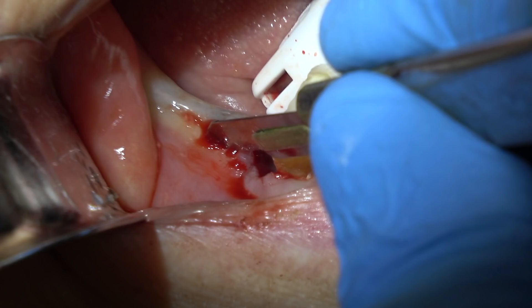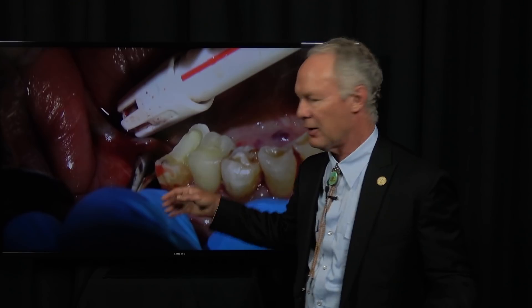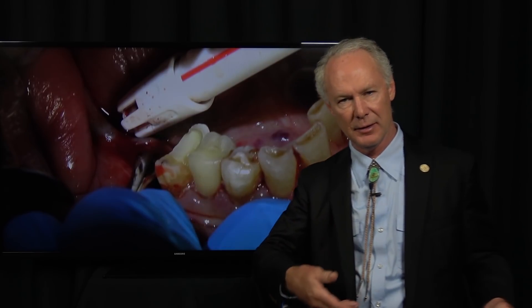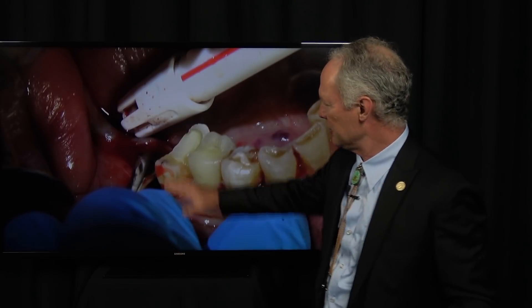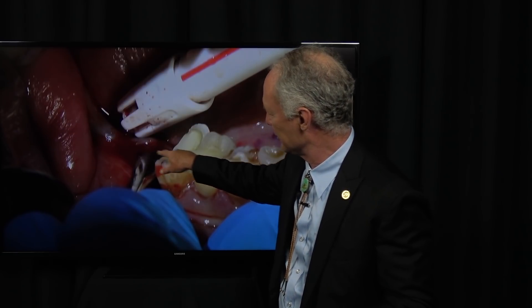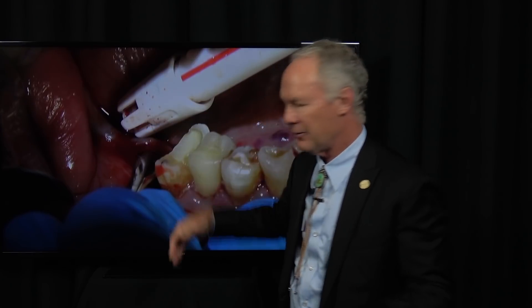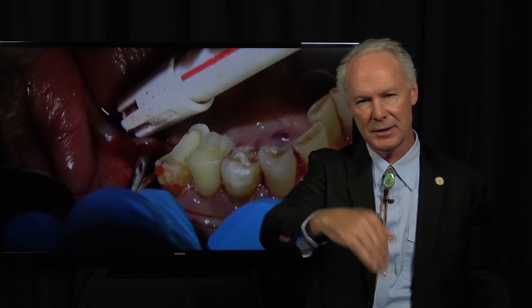Now I'm cutting a distal wedge, and then you want to undermine the flap on the lingual and the facial just a bit so you can place your membrane under the flaps. If you just place a membrane flat on top of the bone graft, it's hard to suture — you tend to lift that membrane up as you're suturing. So reflect just a little bit, a couple of millimeters on the lingual and the facial, so there's a place to tuck that membrane in.